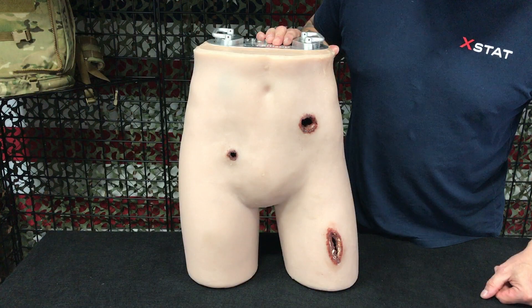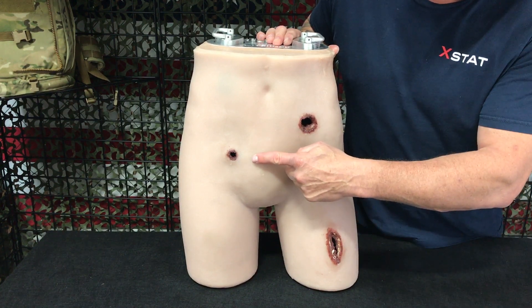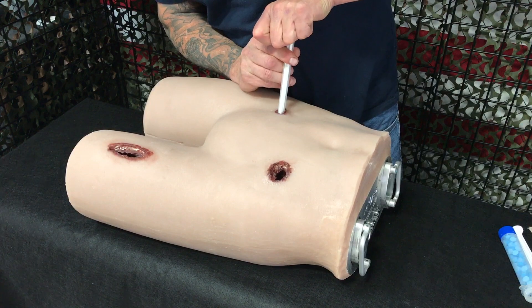The mannequin has three realistic penetrating injuries to choose from. A narrow entrance pelvic wound. These types of wounds are difficult to pack and may not have an exit wound, commonly caused by small caliber handguns, shrapnel, and stabbings.